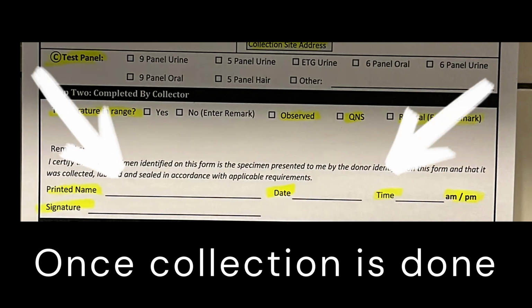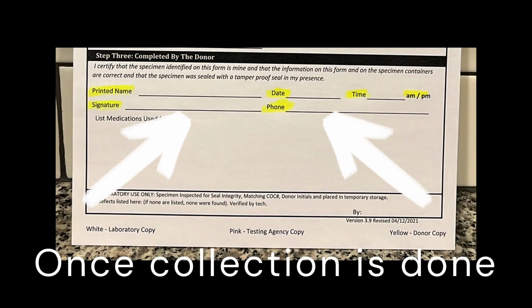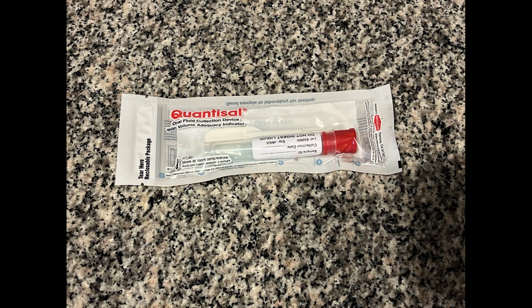Please don't forget, you're going to have to sign, print, date, and time as the collector, and then the participant will also print, sign, date, time the specimen, and please have them put in a phone number.